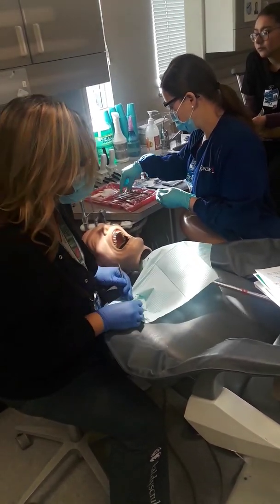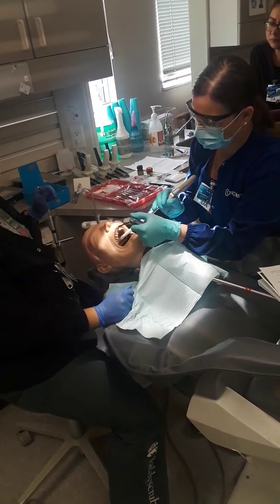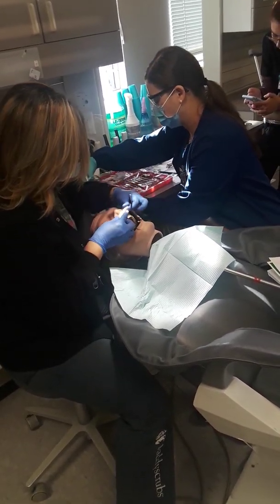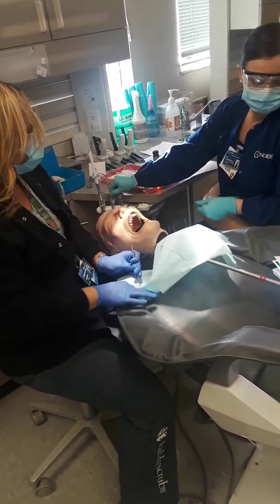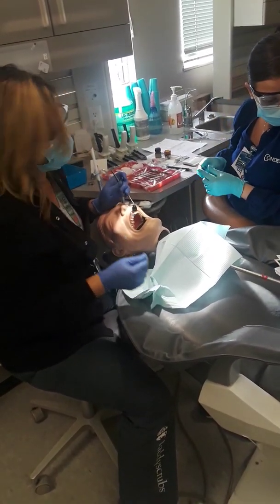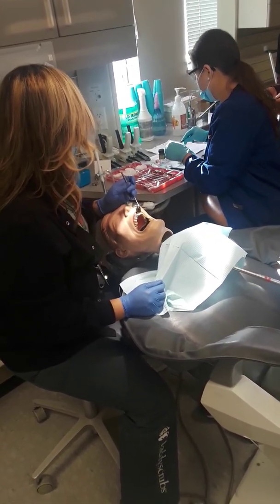And then rinse and dry, right? Yep, nice dry. Probably put another cotton roll in. Cotton roll is protecting the lip and keeping that tooth isolated. So we placed the cotton roll, now we're going to pass the cord.